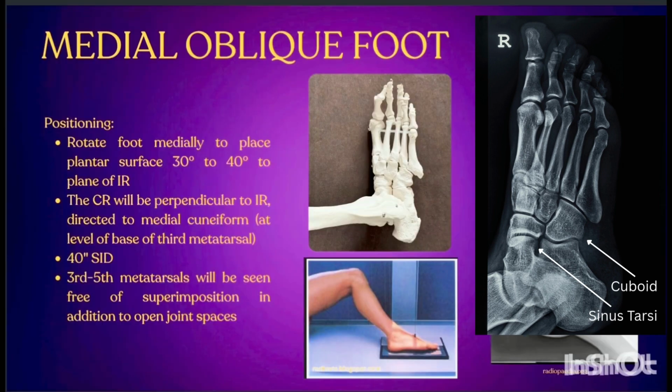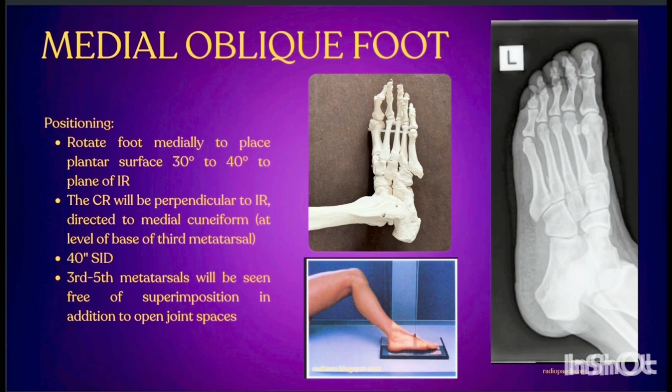So in my clinical experience, I often find that the medial oblique projection of the foot is under-rotated. Ideally, you want to rotate the patient between 30 to 40 degrees medially in order to obtain a diagnostic X-ray. It's important to know what anatomy you should see when positioning your patient for each projection. This is essential in determining whether you have correctly rotated the patient or not.